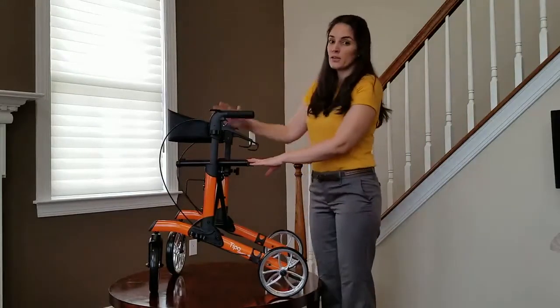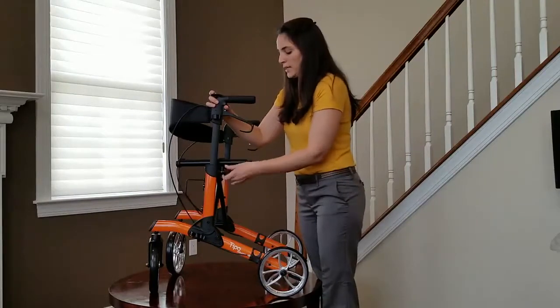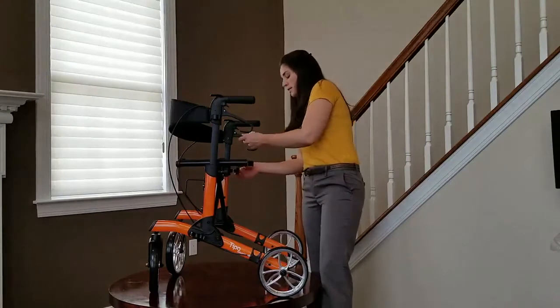Now you can adjust the handle heights. Turn the knob, pull it up to the desired height, and you can use the numbers as a reference. Do that on both sides.